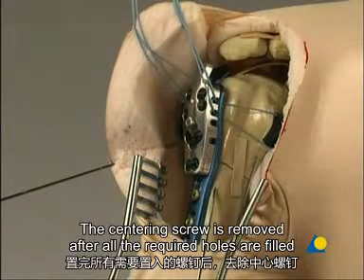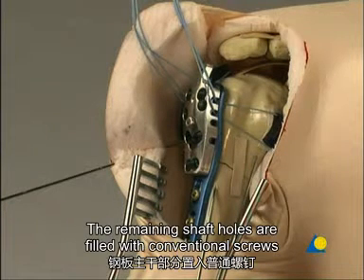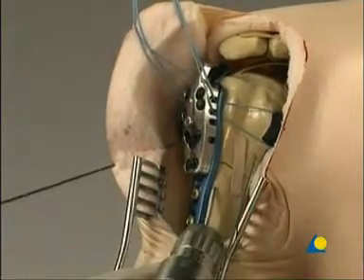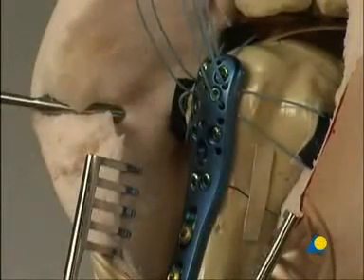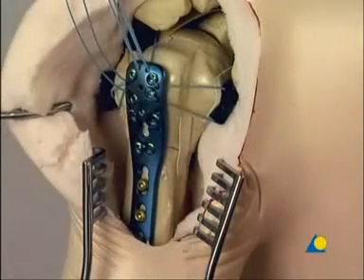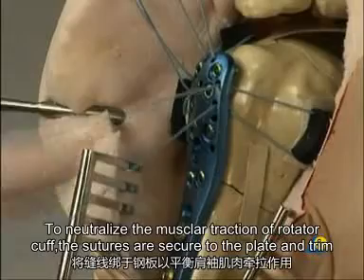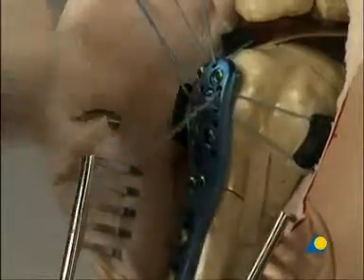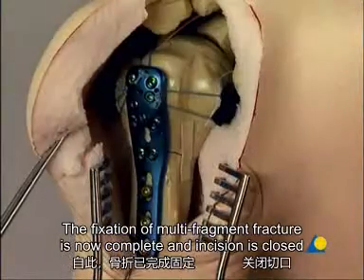After all the required holes are filled, the proximal fixation of the plate is complete. The remaining shaft holes are filled with conventional screws. The temporary K wires, as well as the aiming device, are removed. To neutralize the muscular traction of the rotator cuff, the sutures are secured to the plate and trimmed. The fixation of the multi-fragment fracture is now complete, and the incision is closed.